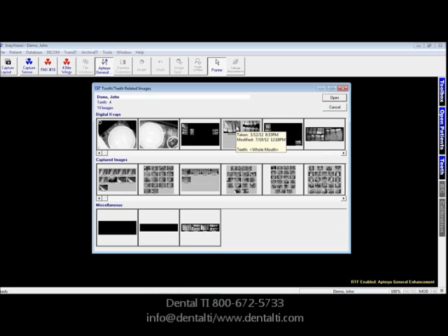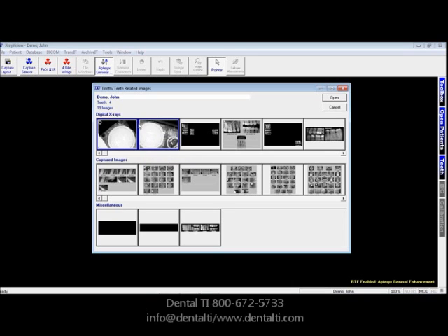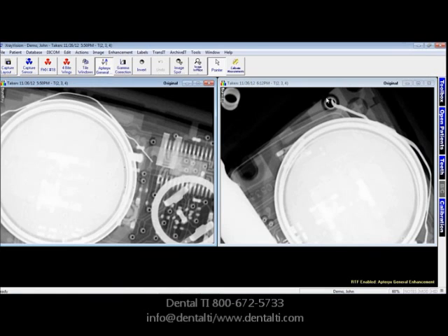That would be one option. If you wanted to open the images, you can click on the individual images — they will be highlighted in blue — and then click Open. That will open the images that have tooth number 4 on them that you have selected.